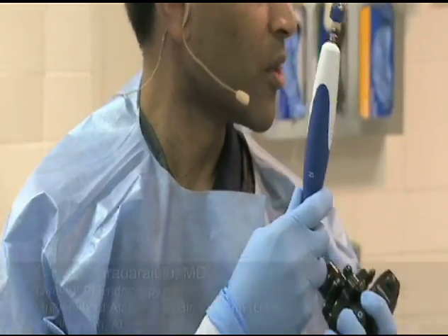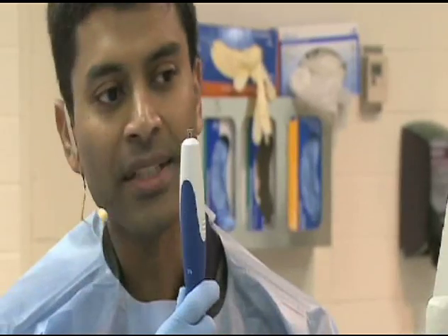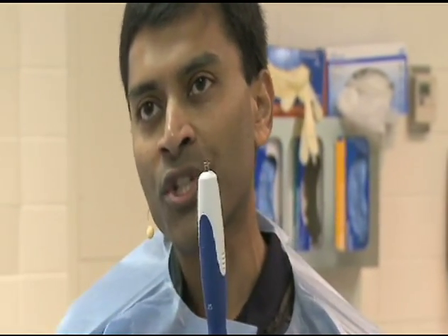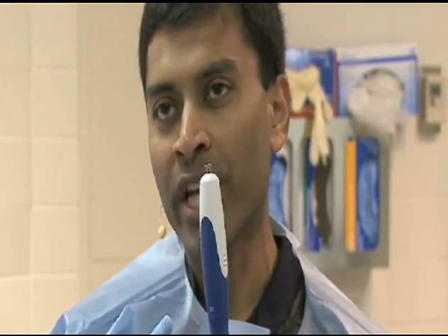Once the needle is in the mass, we remove the stylet and I'm going to demonstrate something called the fanning technique. The fanning technique involves making a pass into the lesion and moving the needle back and forth into the same mass. Preliminary studies have shown that you procure more tissue and get increased diagnostic accuracy by doing the fanning technique rather than going through the same path of the needle over and over again.